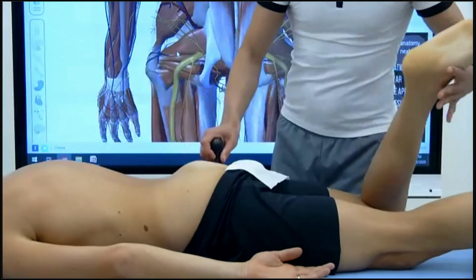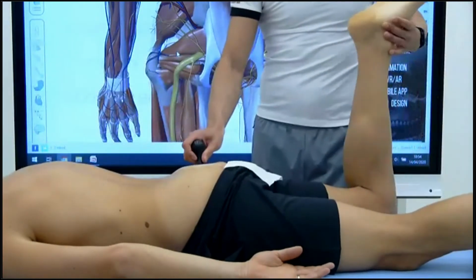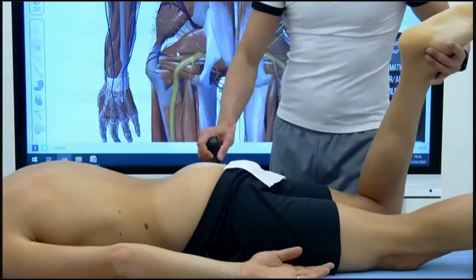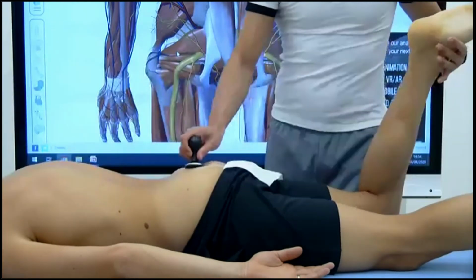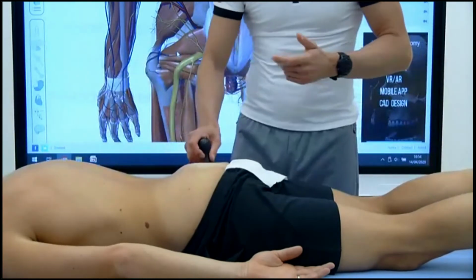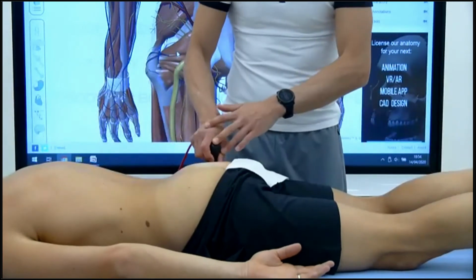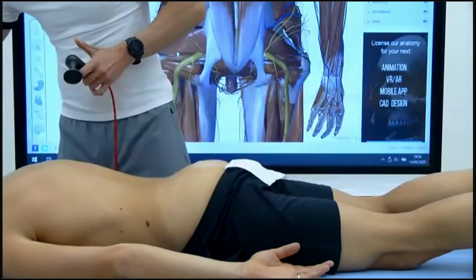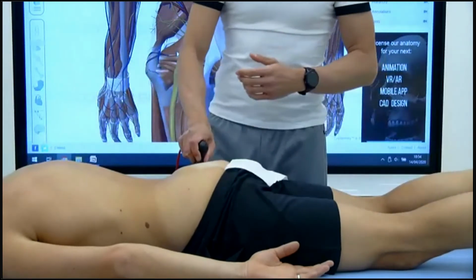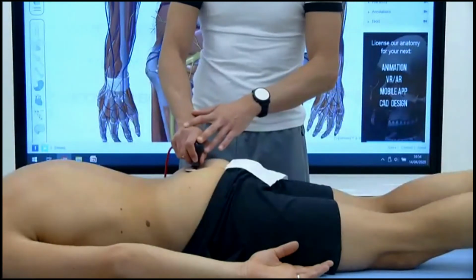I can also start with a relax in here. Damiano? 5. Okay, I set up 62% of power. The current is around 300 milliamperes. Damiano is perceiving a 5 on the 0 to 10 temperature scale, a perception of warmth, and he's just going to relax. And okay, now we reach 7, so I can reduce. I can also use my hands and also a thermometer, like we said last time, to be sure that we are in the right therapeutic window.